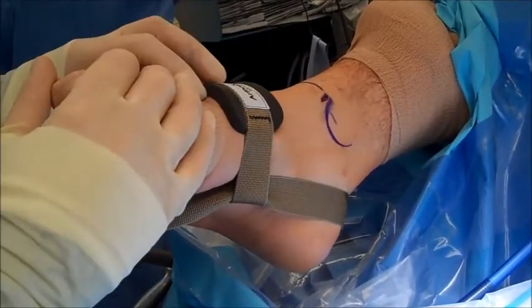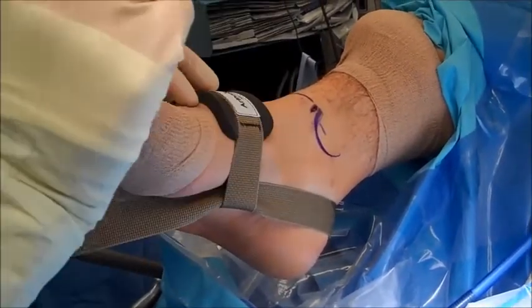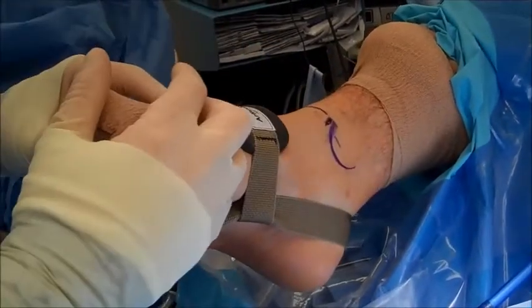In this case we're doing an ankle arthroscopy where we're removing the damaged cartilage and drilling the bone, or hitting it with a pick. That will actually grow new healthy cartilage. It's not the same stuff you have when you're 15, but it's better than not having any at all. We'll also clean out all the scar tissue within the joint.